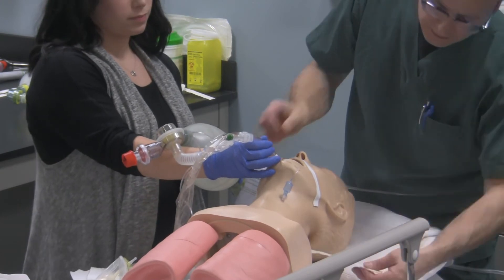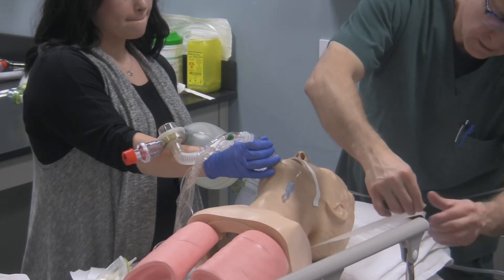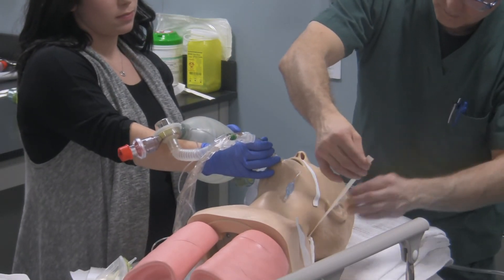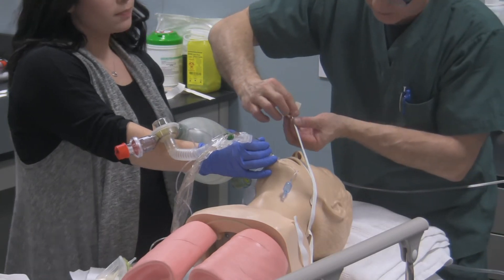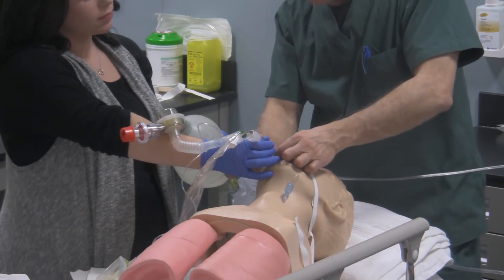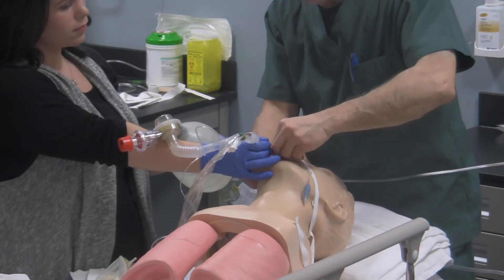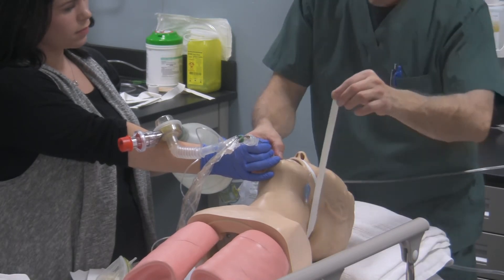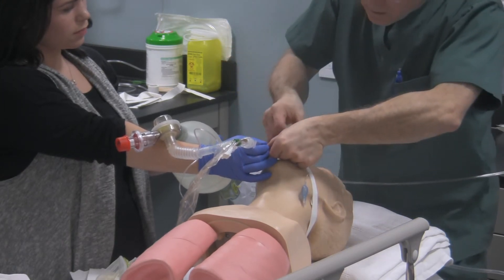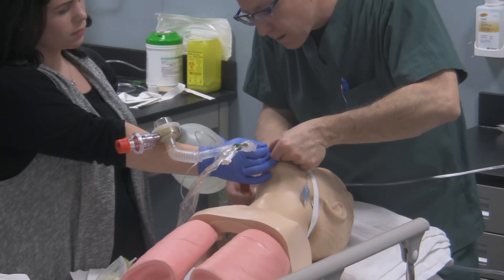Brittany, you take the tube. I'm going to now do the same thing from the opposite side. Which tape do I use first? Top one — so bottom, top, top, which this one is. Then bottom — this one goes all around, and now I'm going to secure the tube from the top going the opposite direction around the tube. Once that's done, I grab the last piece of tape — the bottom one — which comes right across and ties everything in place.